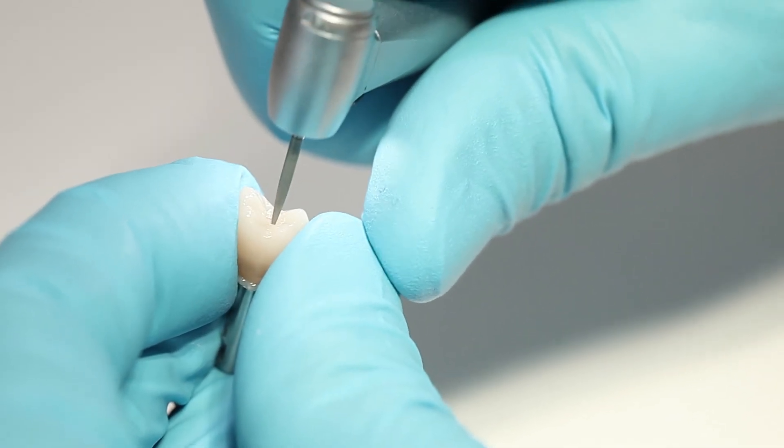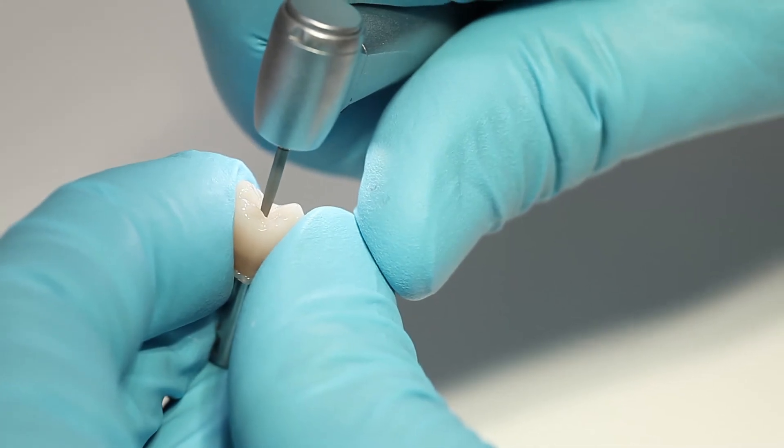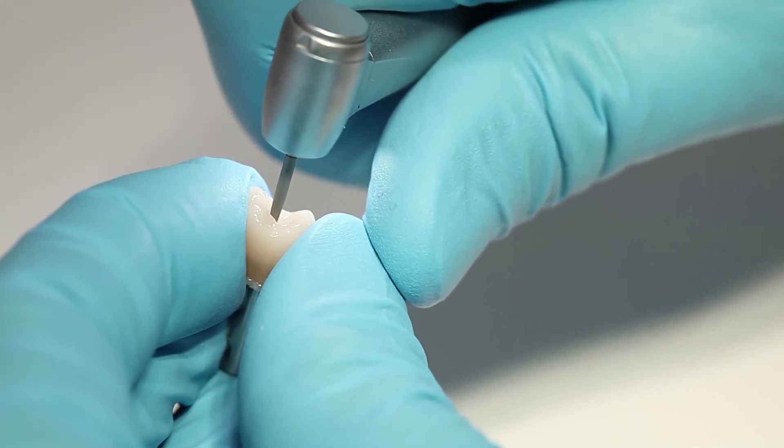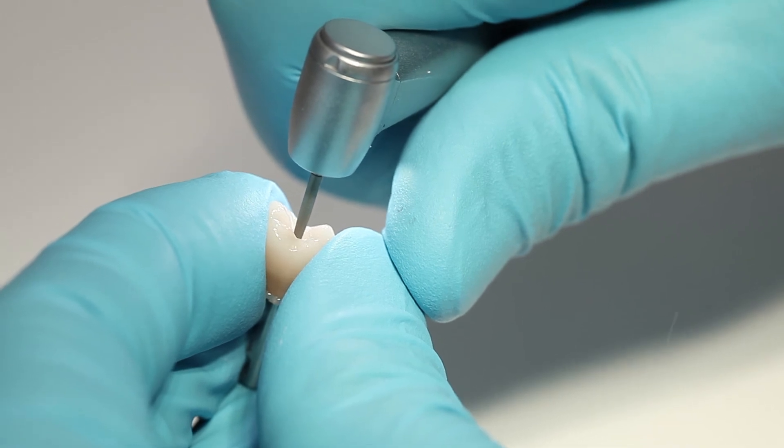If cement residue is left in the screw channel, remove it with suitable rotating instruments. Be careful not to damage the tie base.